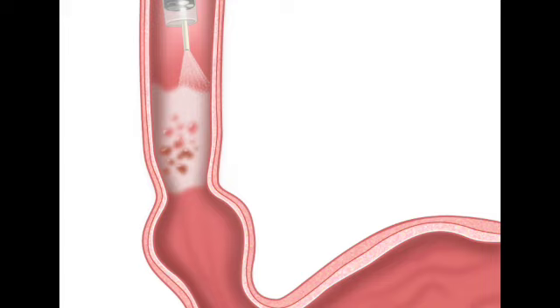That's a great way to visualize it. Which makes sense, I guess. It's like you paint a floor and walk backwards so you don't step in your own wet paint. Right? Yeah, or in this case, you pull the camera back so the lens doesn't smear the mist you just laid down. Oh, right. You don't want vinegar all over your expensive camera lens. Exactly. It ensures a perfectly even coat over the delicate tissue. They systematically paint the walls of the esophagus as they pull back. Okay, so we've painted the tunnel.